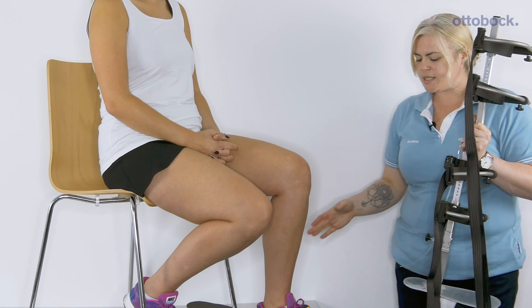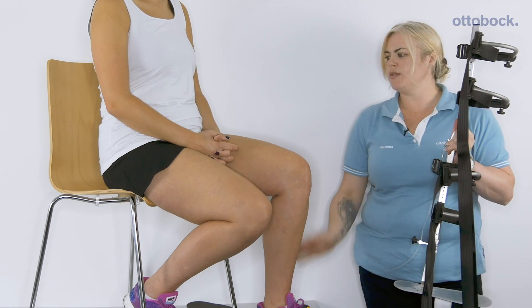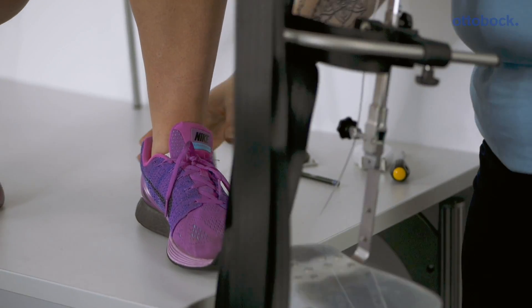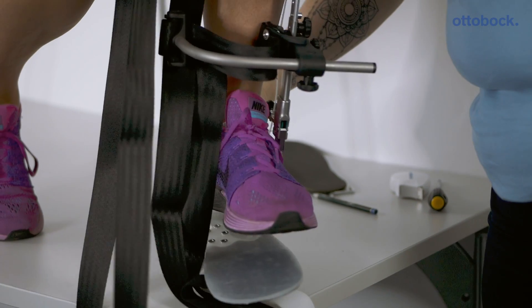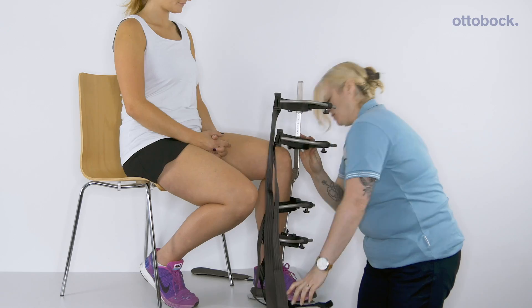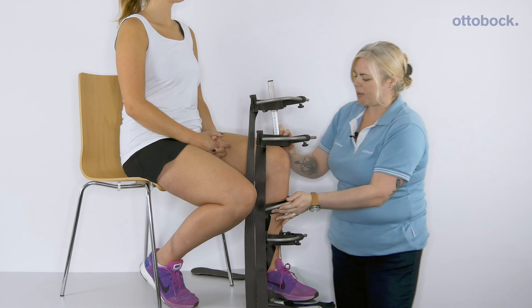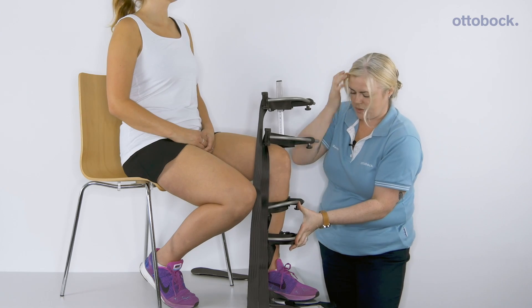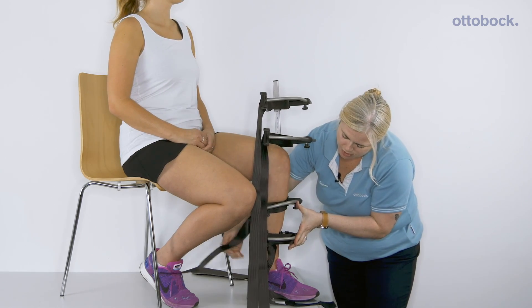In this instance we will always do it with footwear on and clothing on for hygiene reasons. We simply lift the foot into place and initially we will keep it locked in whilst we adjust the bottom two straps.